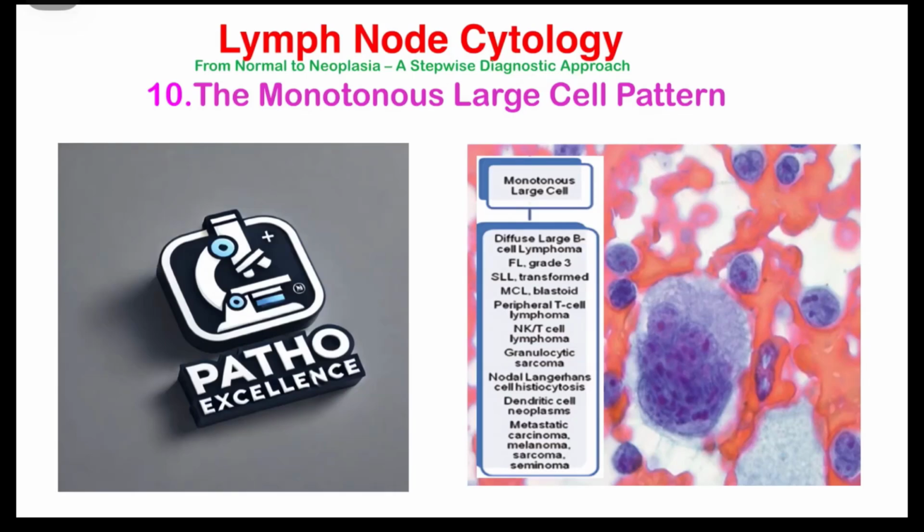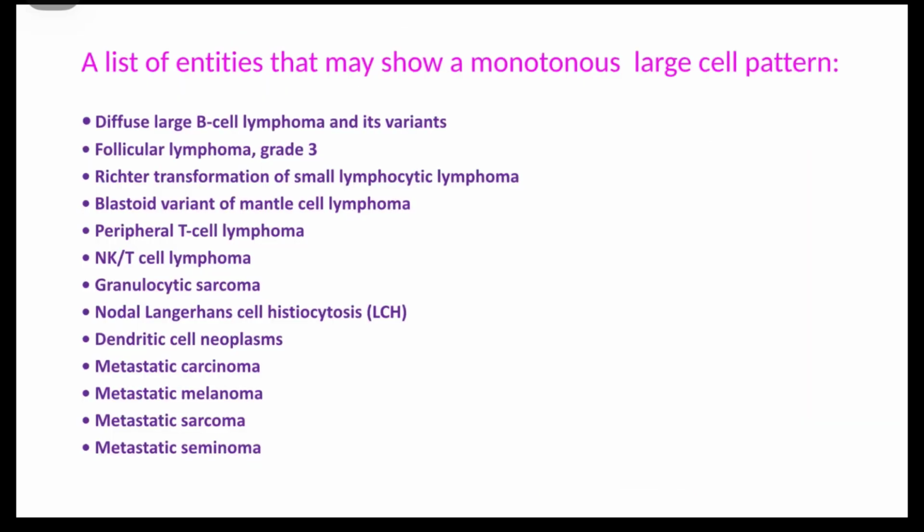In this lymph node cytology video series, today we are going to discuss the monotonous large cell pattern. In previous videos, we have discussed monotonous small and intermediate cell pattern. Now, in this topic, we will discuss what exactly the definition of monotonous large cell pattern is and what are the different entities which can show this large cell pattern.